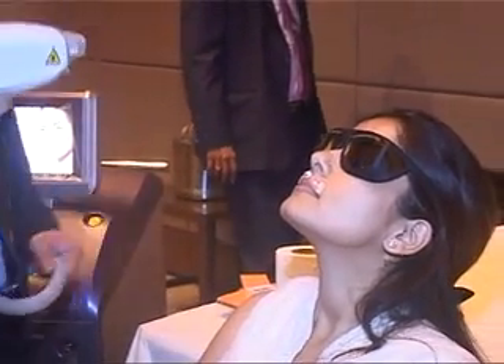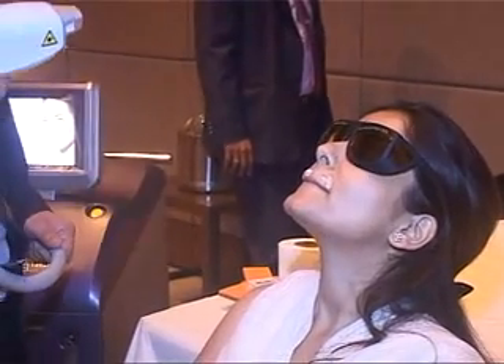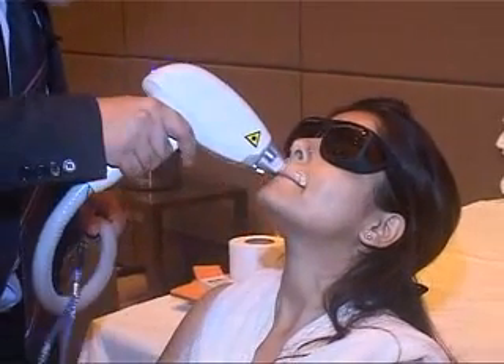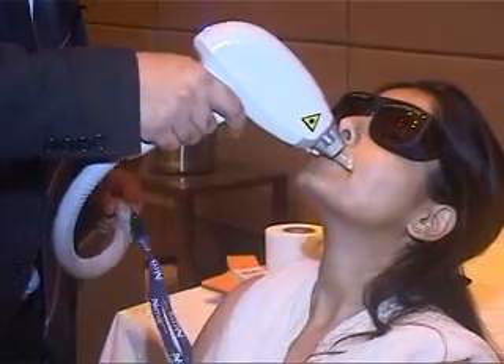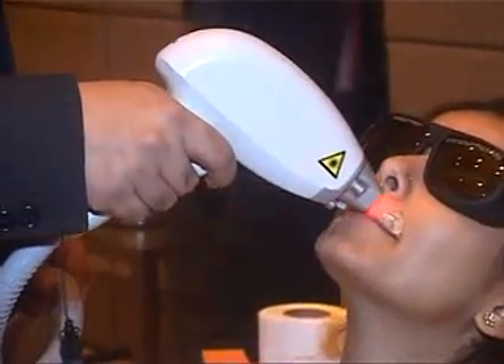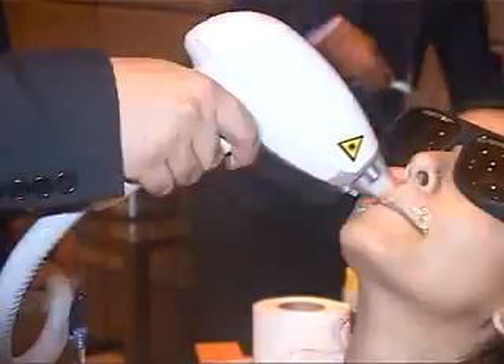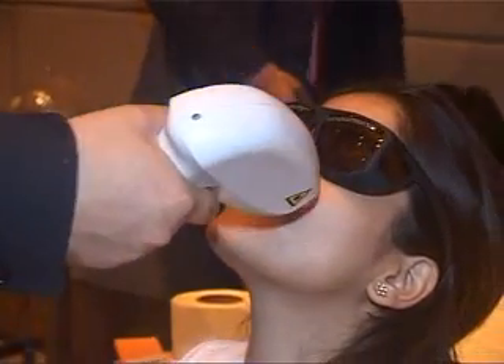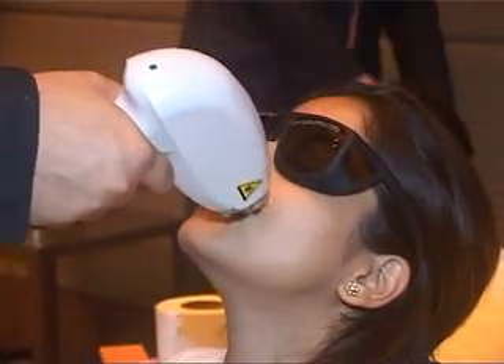We require two switches to be pressed — one is the foot switch, but for double safety there is a hand switch as well. We start off with this area. Let me know if you feel any heat. Are you okay? How does it feel? Warm — that's fine.